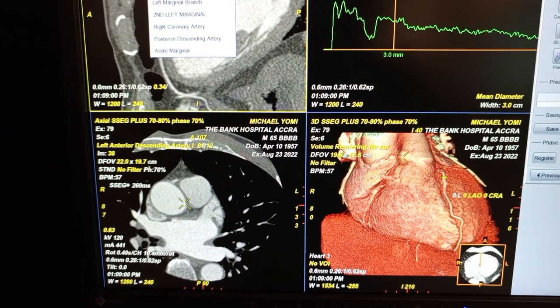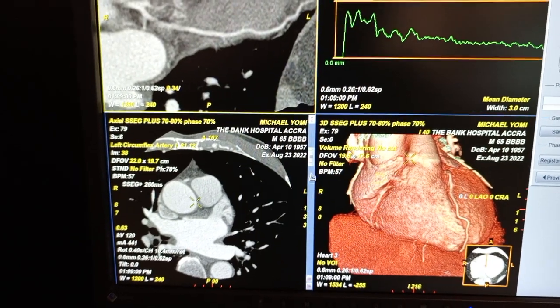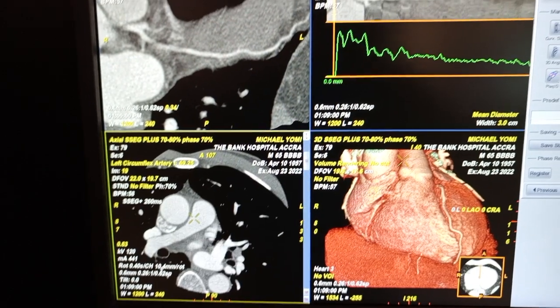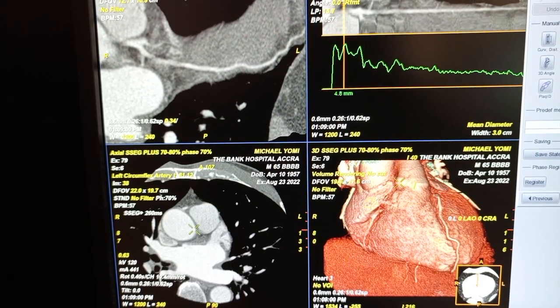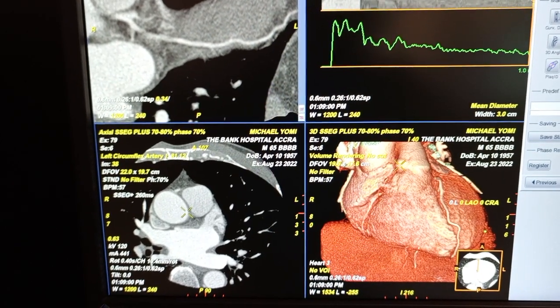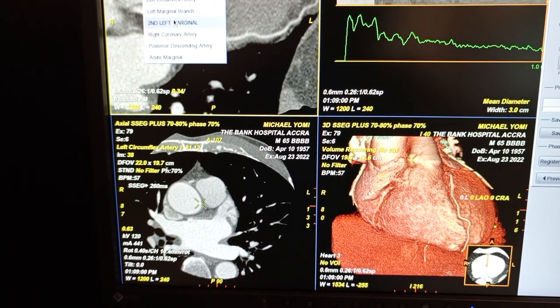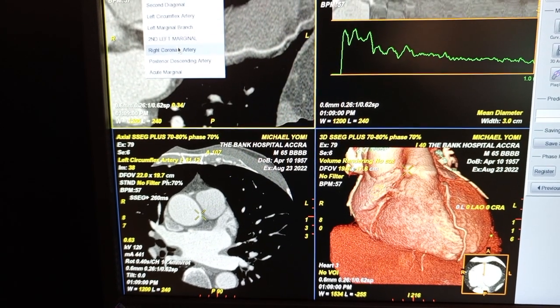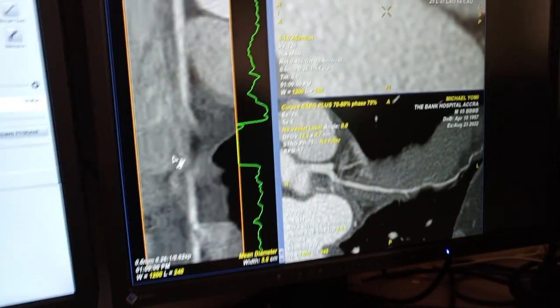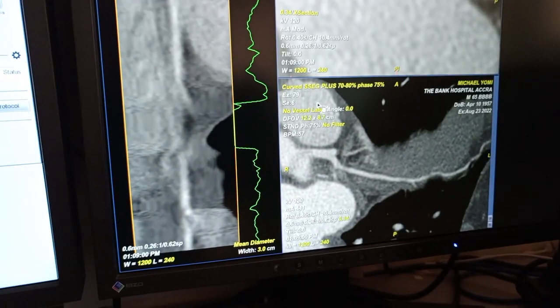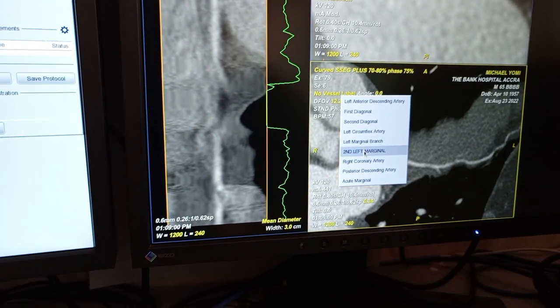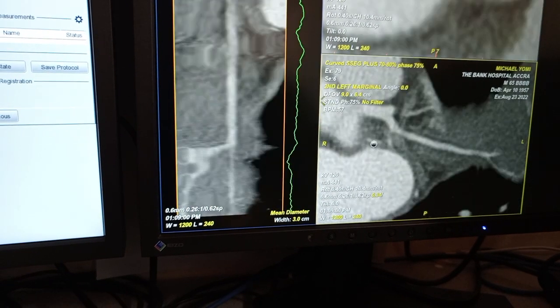Let's look at the circumflex — this is the circumflex. Let's look at the right coronary artery — it's showing this way. Now let's look at the first marginal.